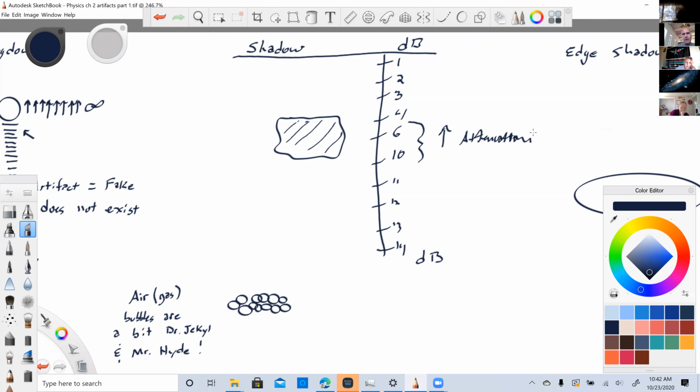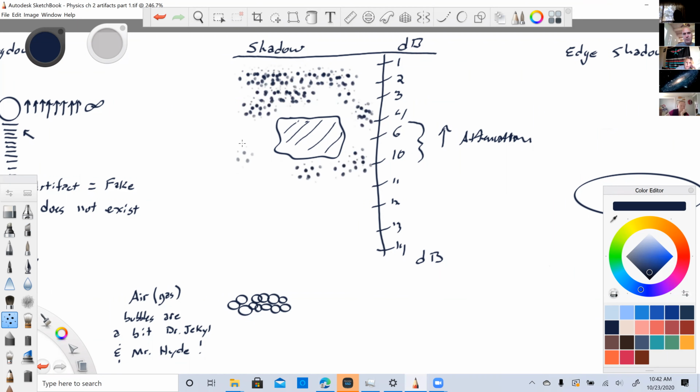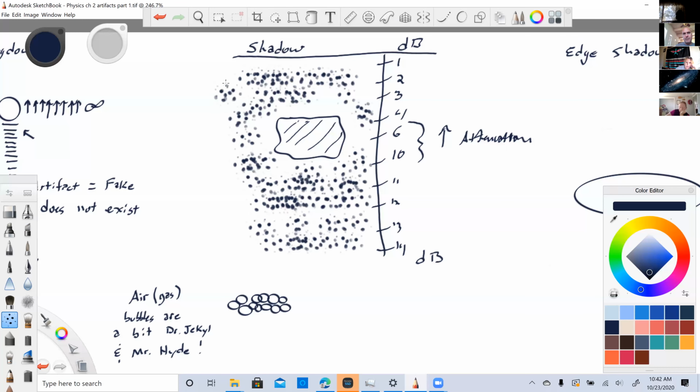So what happens here is, well, let's see, I need a material. We need some kind of background tissue. This is just regular tissue, a little speckle pattern in it. Should have drawn this first. Okay. The machine doesn't understand what happened. And so all it knows is that down here, it has 11 decibels of attenuation and then 12 decibels of attenuation. That's more than expected.